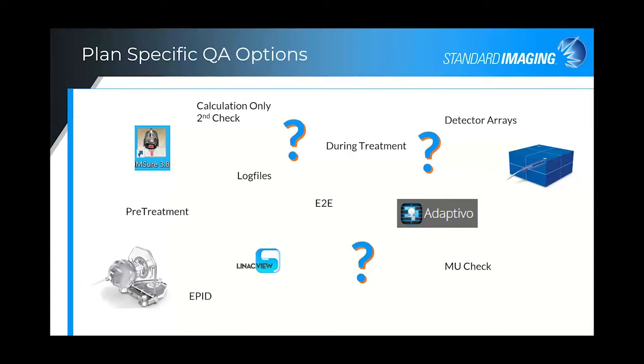What is typical varies from clinic to clinic, as well as regional differences due to available staff, budget, regulatory requirements, and/or billing-related issues. So when taking all of these into consideration, which types of patient-specific plan QA are best suited to your clinic? As physicists, we want to catch and allow for correction of minor workflow issues that may have crept in systemically, as well as one-time minor workflow issues. And of course, always catch the major potential mistreatment errors before they occur.